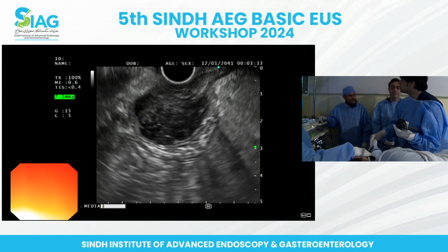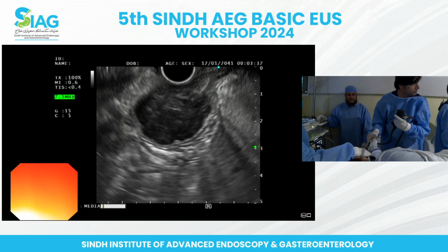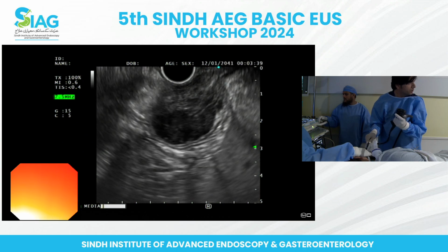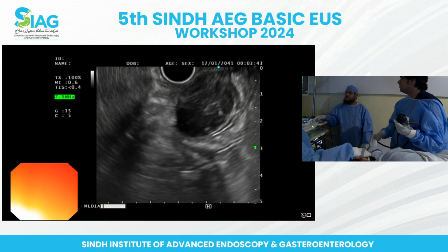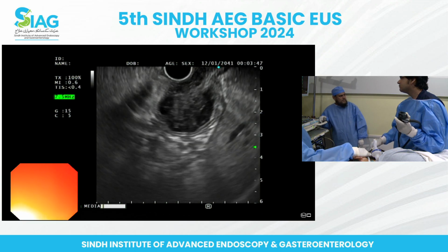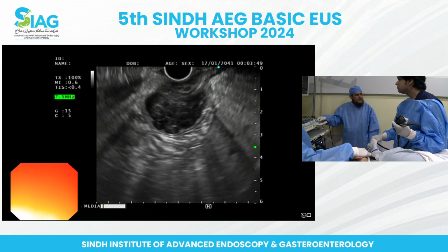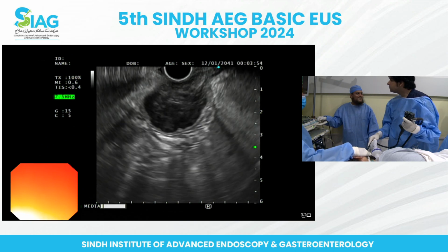Oh, excellent. So we've got a 2 centimeter core, I think. Can we have a look at that? Let's see if we do need enough, or do you seem to have. Yeah, single core, we've got a decent sample. It's a nice tissue sample, yeah.